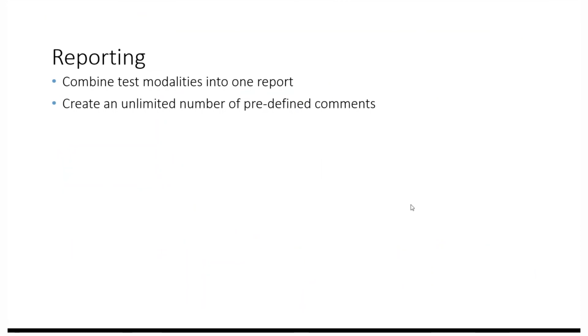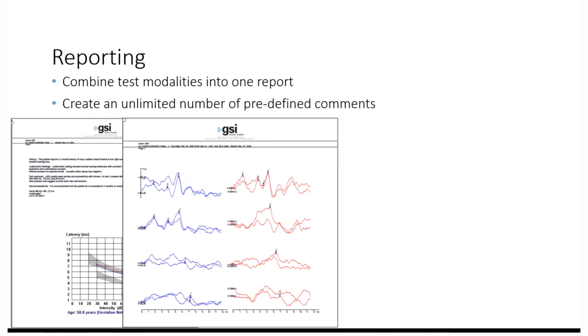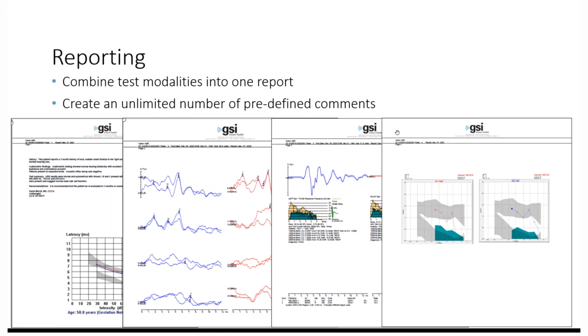For reporting, you can combine test modalities into one report. I'll show you that. And you can also create an unlimited number of predefined comments. So that will really save time down the road as you collect your ABRs. This is page 1 of a report that has my logo. You can put your logo in there if you'd like, as well as history and test summary and latency intensity function. Page 2 is my waveforms. Page 3 is my TE results. And if I wanted, I could even do DP in my report. So this is all in one report that was printed from the ABR module.